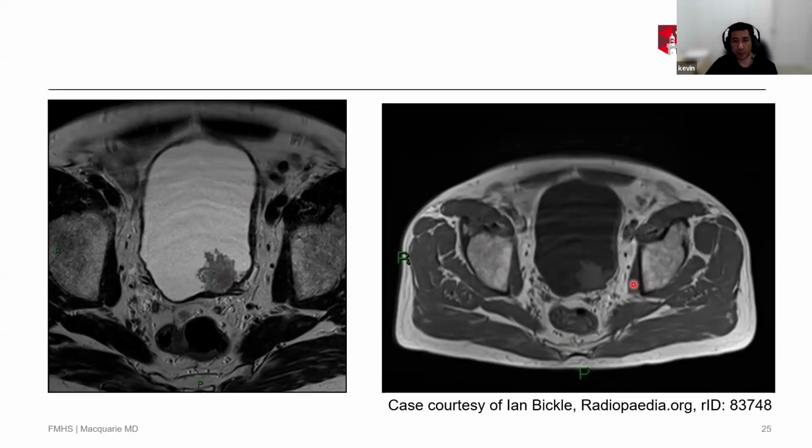If we gave contrast, we would do it on this sequence, and it would make this lesion enhance. They can also do clever things, where if you have a fluid sequence, you can do another pulse across it, which suppresses the fat. So it makes edema and fluid in the tissue stand out better. There are an infinite number of sequences that people can create to image the body using MRI.